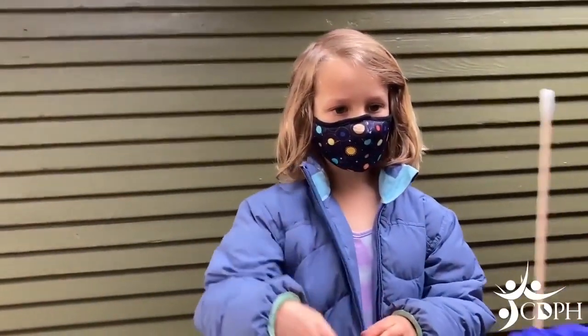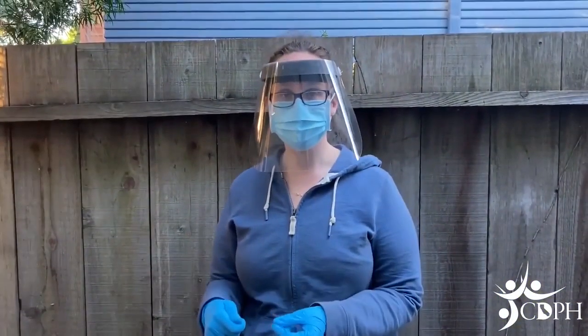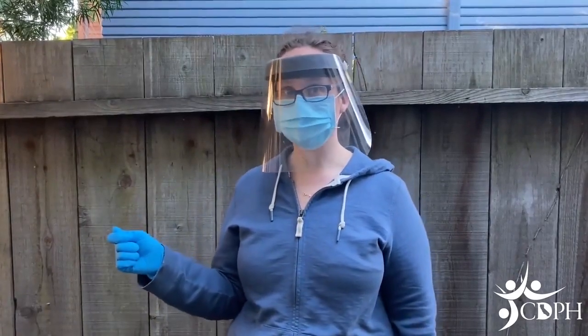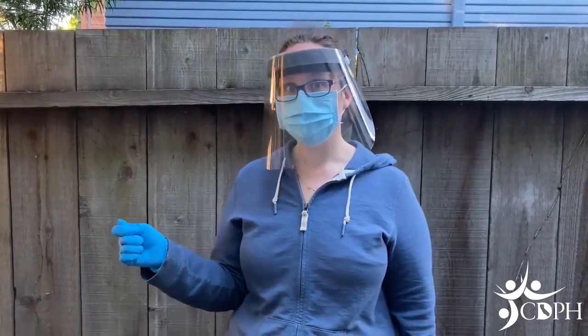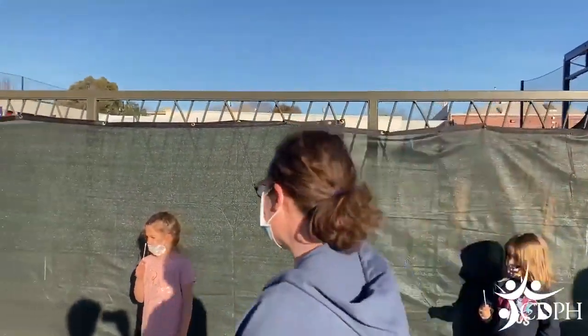You're going to want to take the stick and be careful not to touch it with anything. You don't want to touch the soft part of the swab — that part needs to stay clean. You're going to hold it and wait for instructions, and then when we say so and we are far enough away from you, we are going to have you take down your mask beneath your nose.